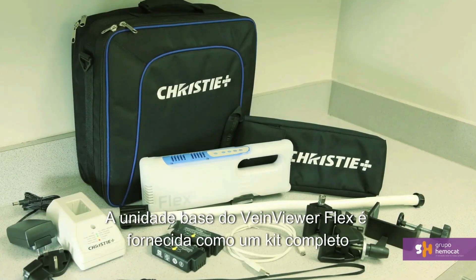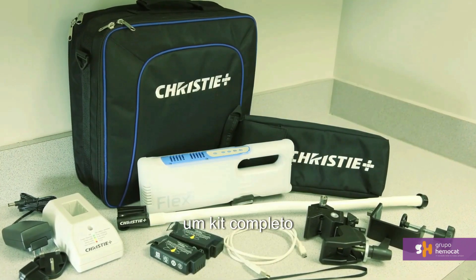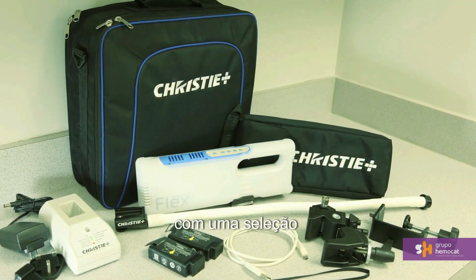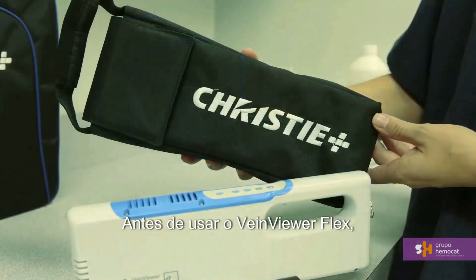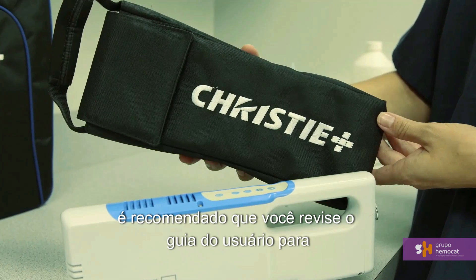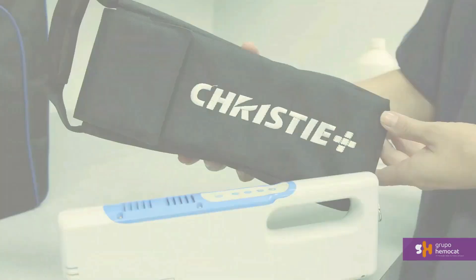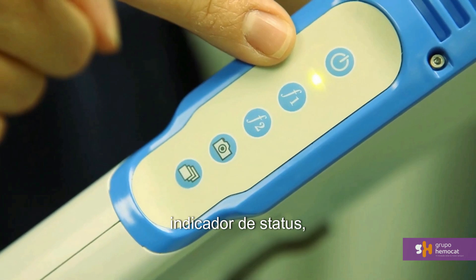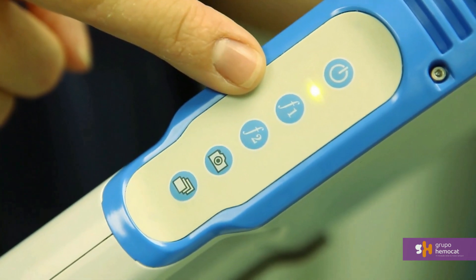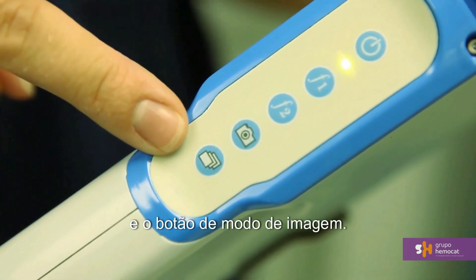VeinViewer Flex's base unit comes as one complete kit, with no consumables necessary and a selection of accessories for ease of use. Before using VeinViewer Flex, it is recommended that you review the user guide for full instruction. The button pad contains the power button, status indicator, function buttons, and the imaging mode button.